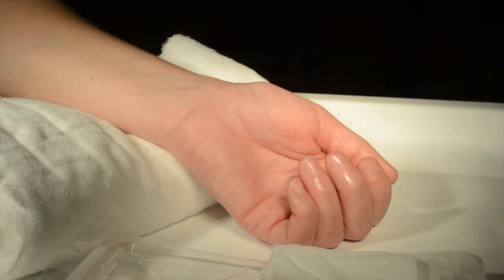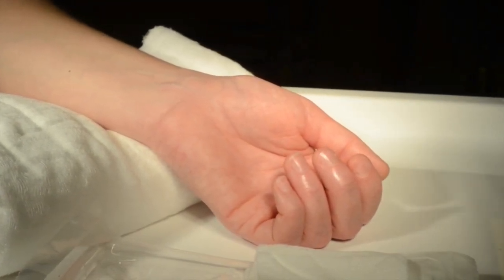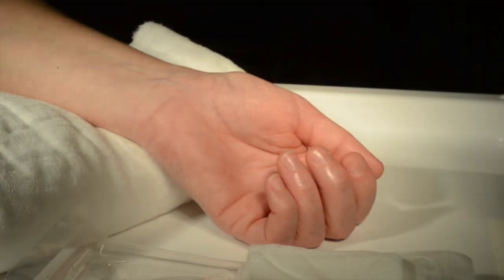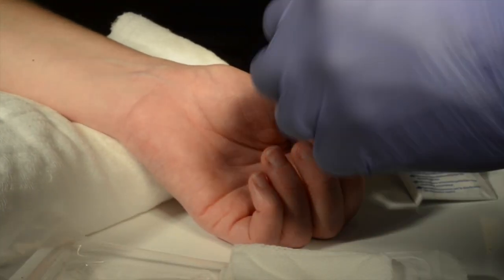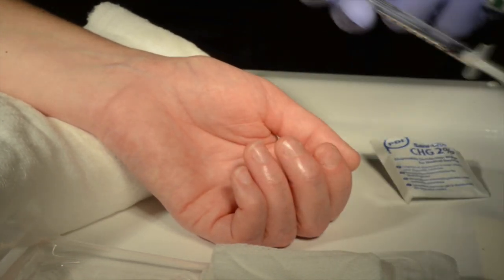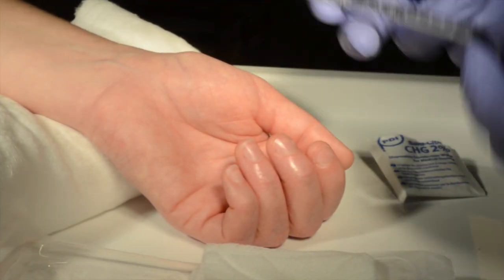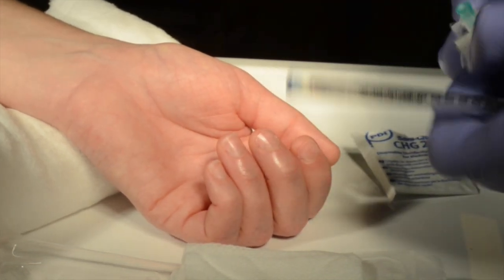Prepare your equipment. Make sure everything is at hand. Ensure you are wearing universal precautions and that you have decontaminated your hands thoroughly. For this procedure you are going to need a heparinised ABG syringe, gauze and alcohol wipe, and a 21 gauge needle.